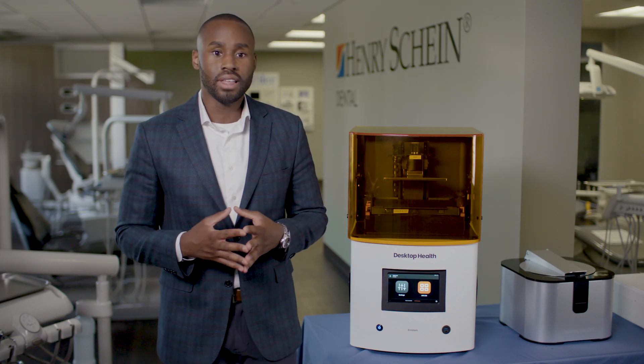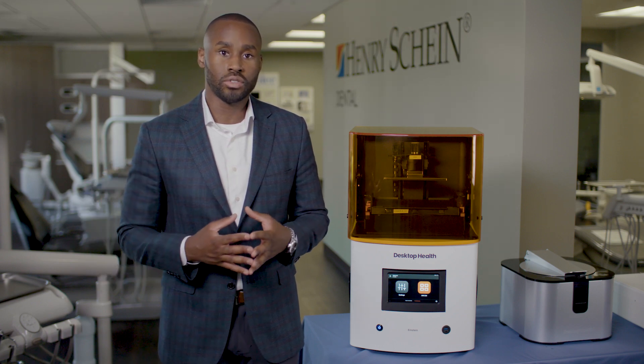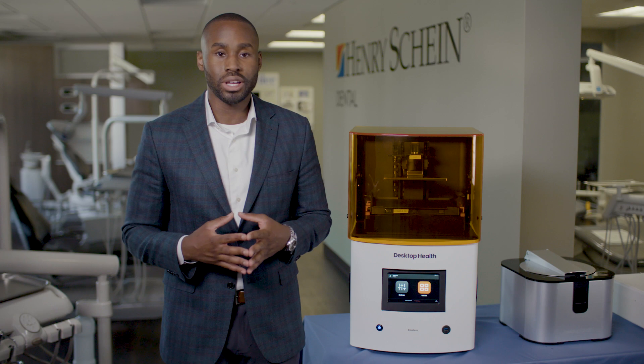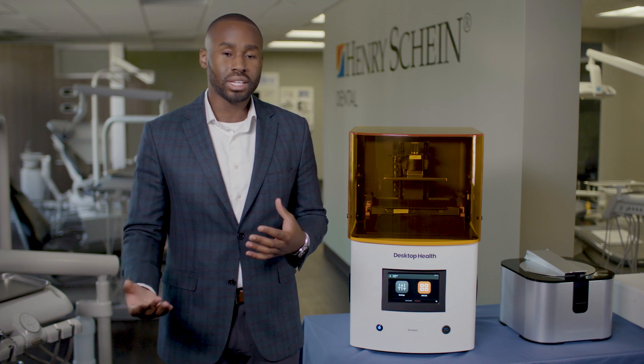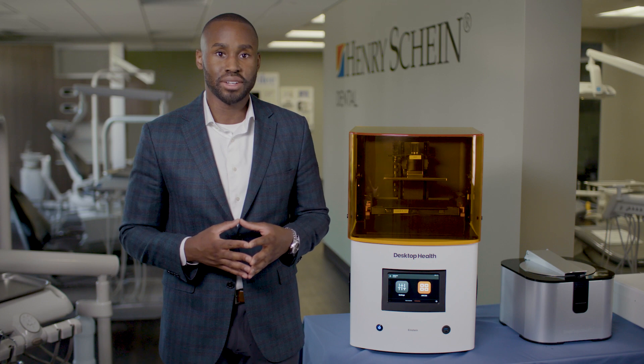The key thing to note here is that you're going to need to insert your drill sleeves before using your surgical guides. Those drill sleeves can be purchased from the manufacturer of your implant system, but once that's done, you're ready to use your surgical guides. Surgical guides are a key part of implantology and truly do improve the patient outcome.